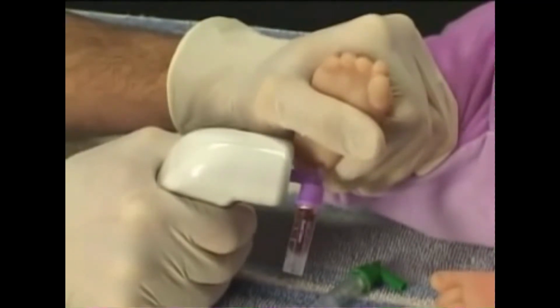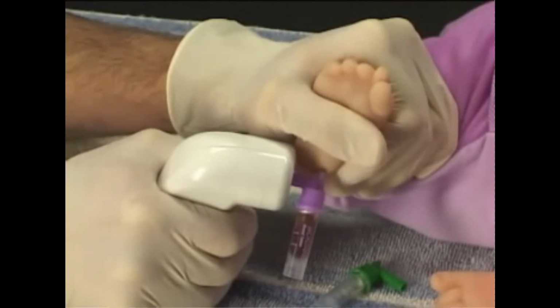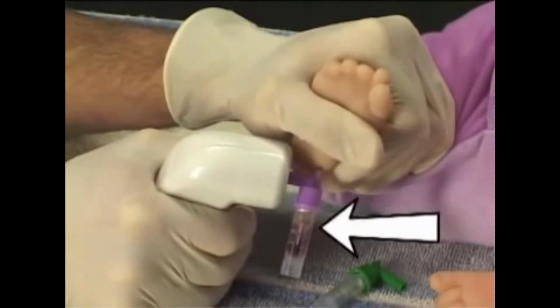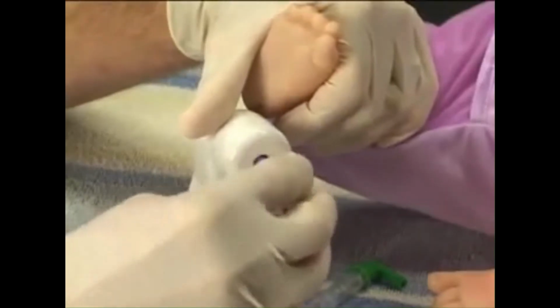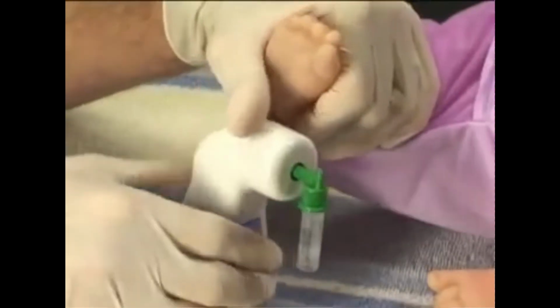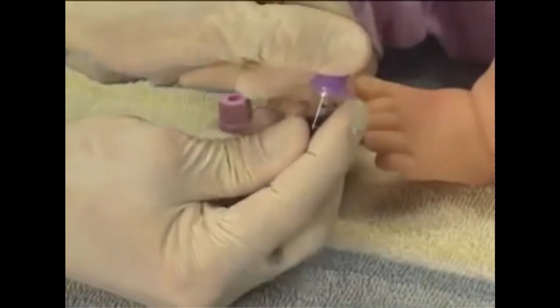You can check the volume of sample collected by pressing and releasing the blue button to stop the vacuum. This allows the sample to settle so you can see the volume of sample collected. Simply press and release the button again to collect more sample. To collect another sample type, simply remove the quick draw assembly you've just filled from the Inovac and attach the next quick draw assembly.